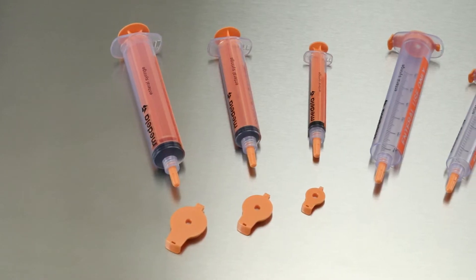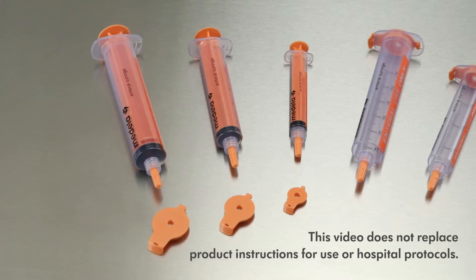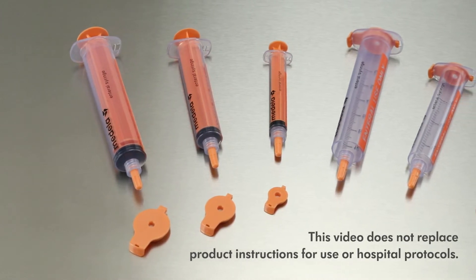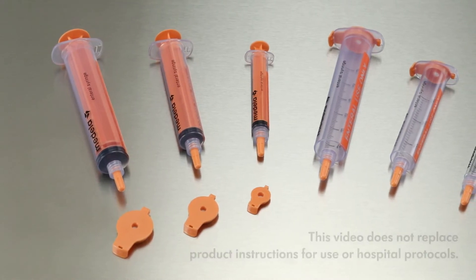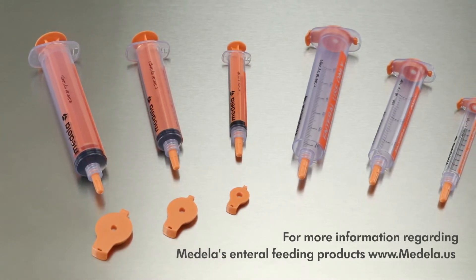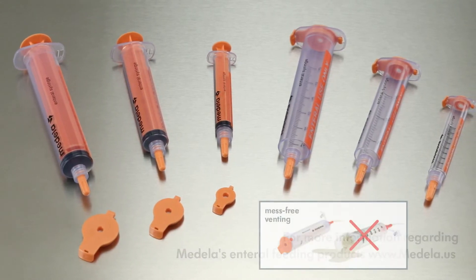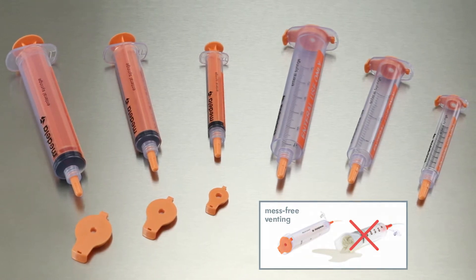Medela Gravifeed syringes are designed for both gravity feeding and venting. The syringes are available in 10, 30, and 60 milliliter sizes. Gravifeed is available in two configurations: with and without the lid attached. The Gravifeed lids include a 0.2 micron hydrophobic filter in the cap that allows for venting and allows gravity feeds to flow. This minimizes exposure to airborne particles or contamination and protects against leakage and spilling.